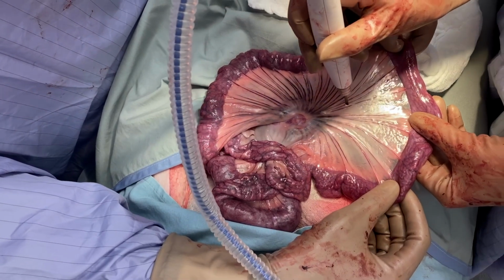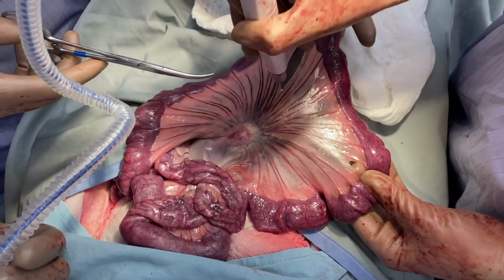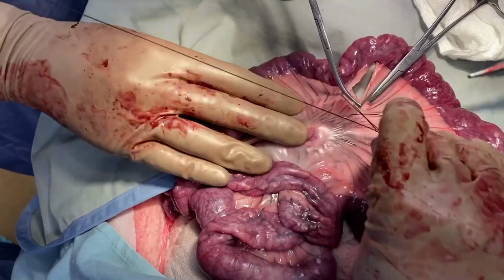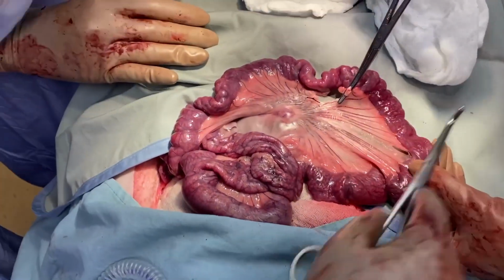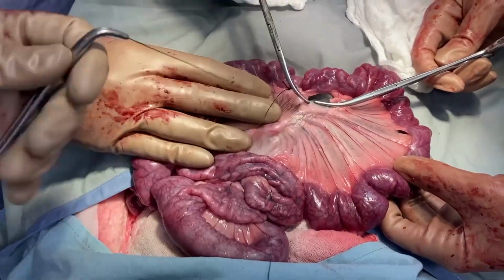To begin the resection, use the cautery proceeding obliquely to ensure that the remaining free edges after resection will have a blood supply. Create windows in the mesentery of the bowel to be resected. Divide the mesentery, ligating the arteries and veins with ties.